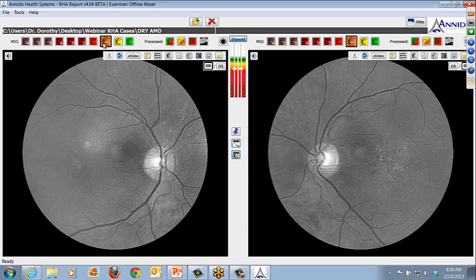Okay, the images need to be good. You often won't see that on the RHA screening, but you have a lot of other things that you will pick up on the screening. So this is something to pay attention to when you have a nicely dilated patient and you're doing a diagnostic screening. And I'll pause there just to remind everyone, remember that the RHA screening is just that.